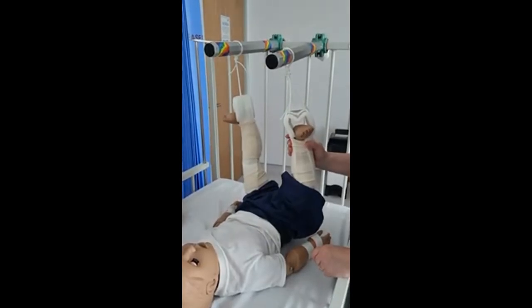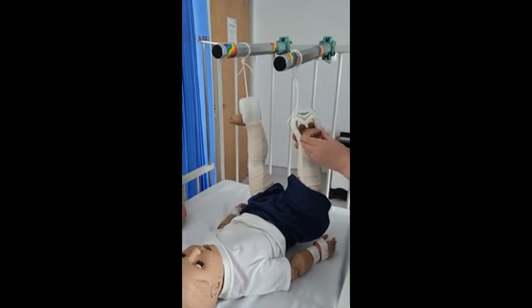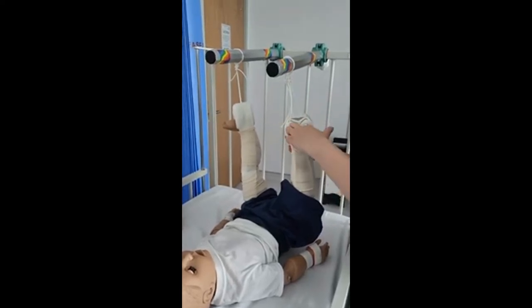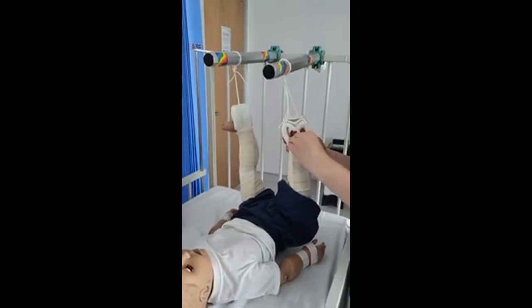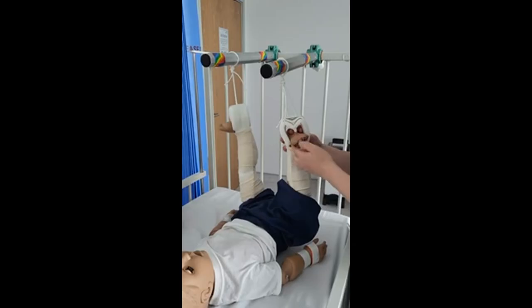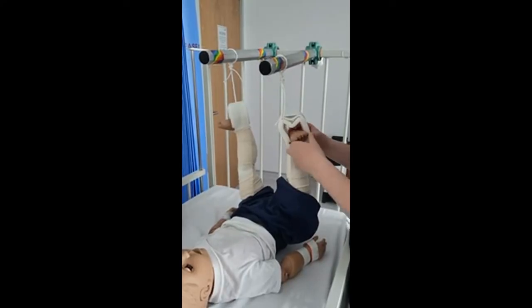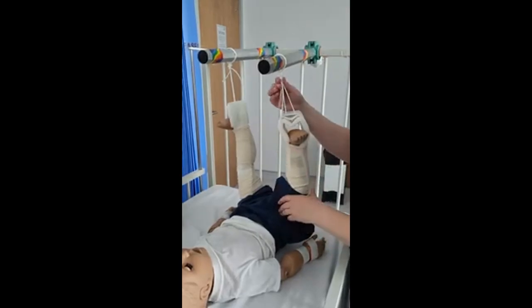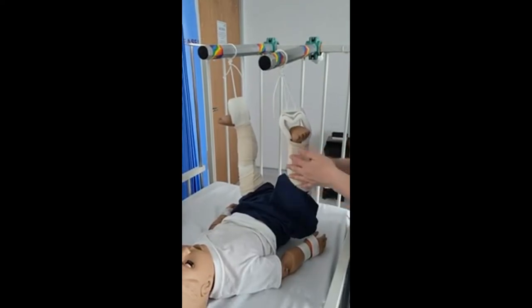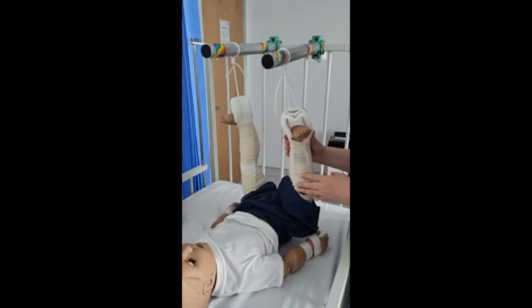Ongoing care of your child in gallows traction. After the gallows traction has been applied, five minutes afterwards we need to check that the toes are still nice and warm and pink and that they've got full sensation. Feel along the base of the foot and each of the toes individually, making sure the child can wiggle their toes — if they're fast asleep you can passively move their toes. We need to feel for the pedal pulse on the base of the foot. Make sure that the bandages are secured, taped, and the knots are nicely tightly tied. After a little while the children will be wiggling around and the bandages will get messy and may start coming off — you need to double check that the skin and everything is in good condition.